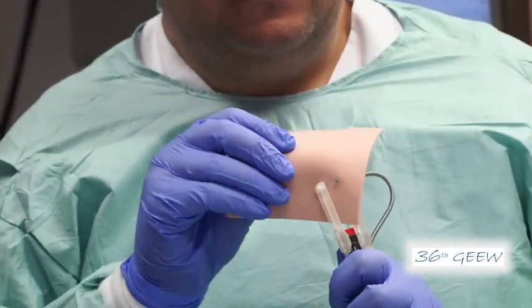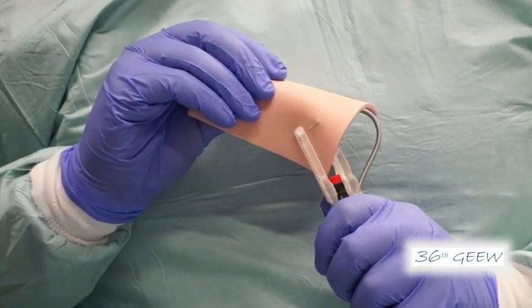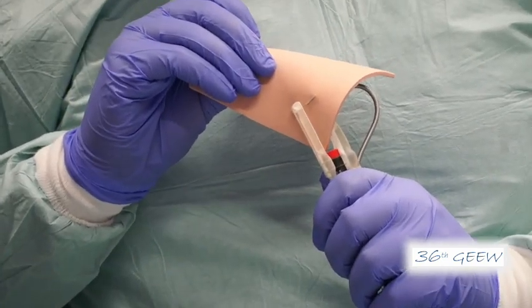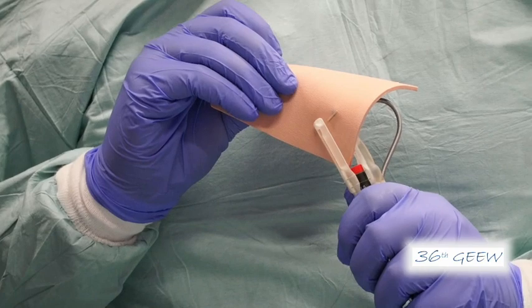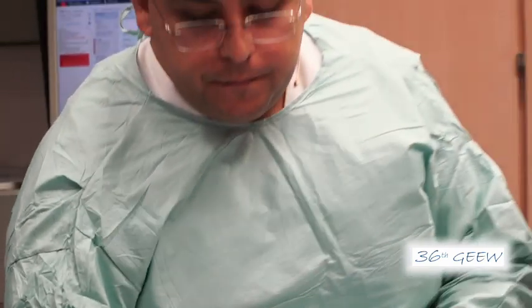You can see here — this is the tag after the full suture. Normally we repeat this again on the opposing wall, and then we pull back both of them to have the full tissue opposition. And I think Vincent is ready for the first suture.